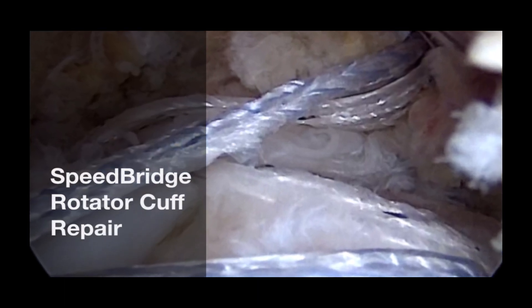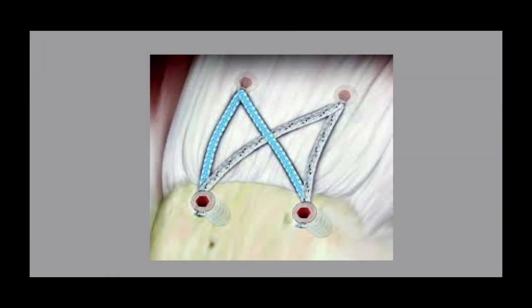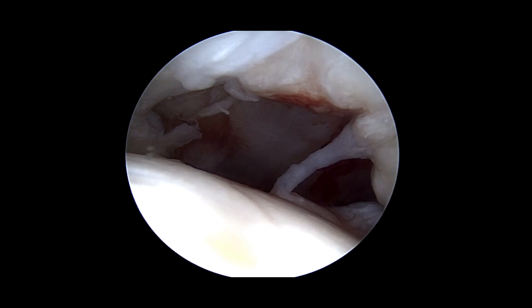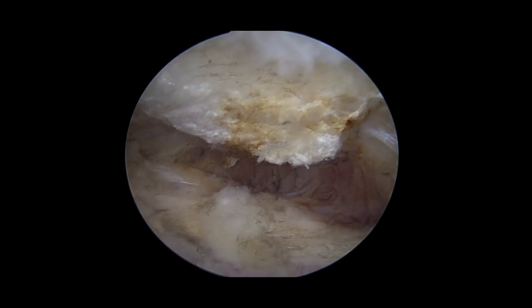Speedbridge Double Row Rotator Cuff Repair. This is the right shoulder of a 53-year-old lady who sustained an acute rotator cuff tear two months ago. Viewing from within the joint, we can see the U-shaped tear in supraspinatus.